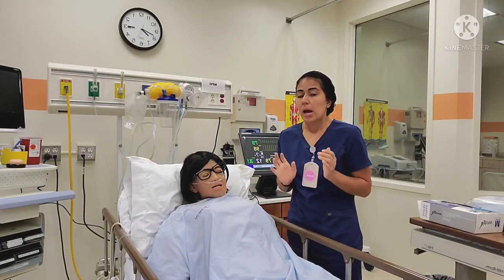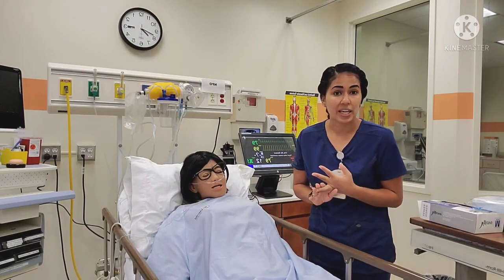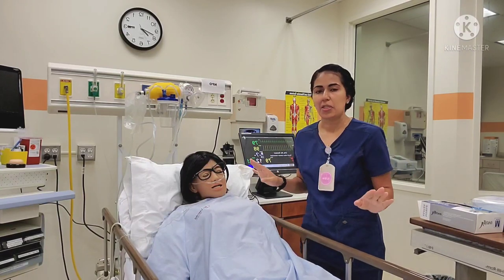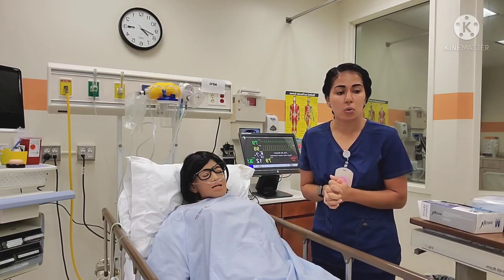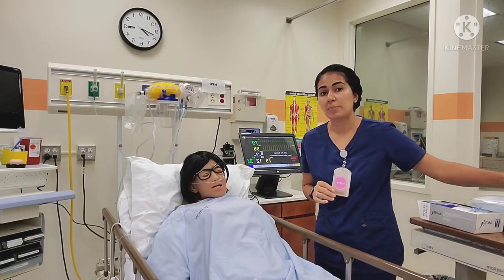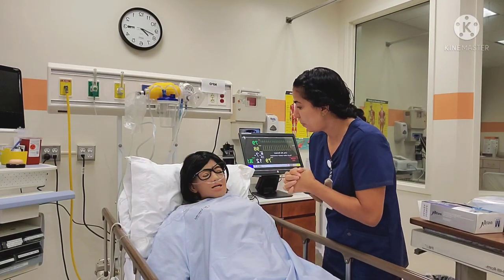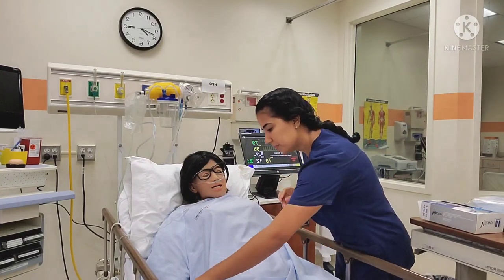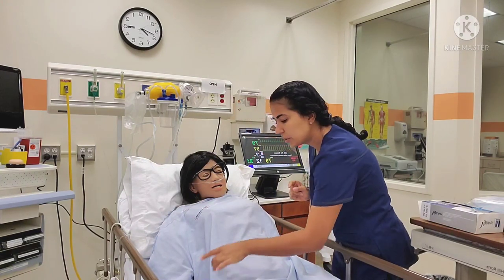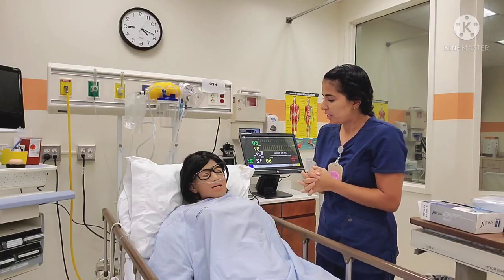The next thing I want to think about is: are there any contraindications for this patient having a urinary catheter? In this case there are none. So now what I'd like to do before I gather my supplies is go into my patient's room and identify them. Can you tell me your name and date of birth? I'm going to check your ID band. The name and date of birth matches my computer, so I have the right patient.